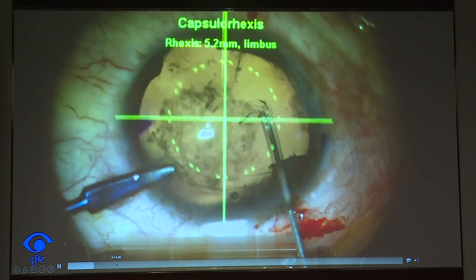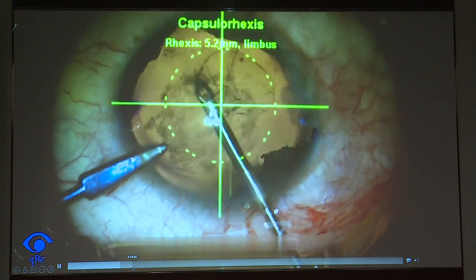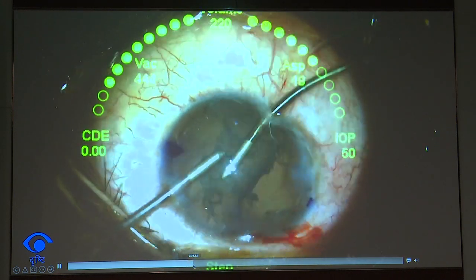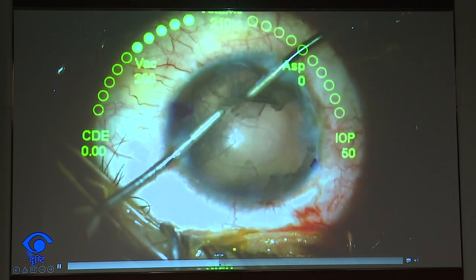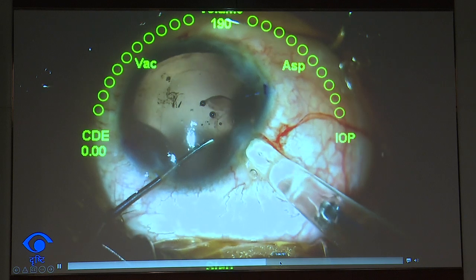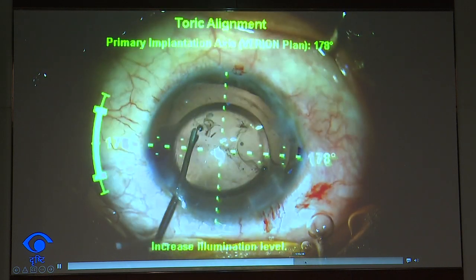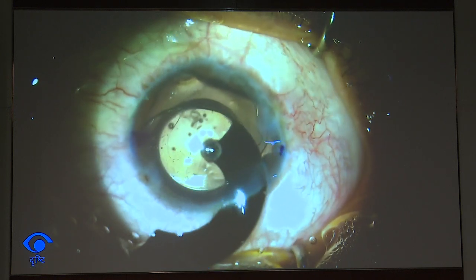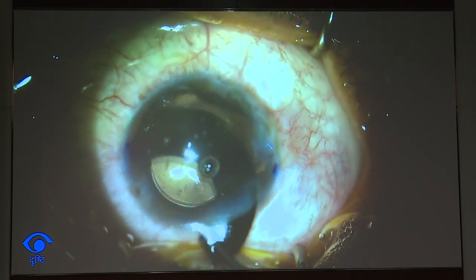Not much to the cataract surgery, and once the cataract was out, we could then put in a toric IOL, position it, and then the process of seeing. So I think, okay, we went with the same ring, and that's why that one is shown there. I'd forgotten.